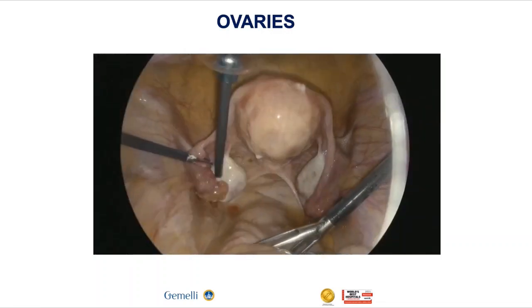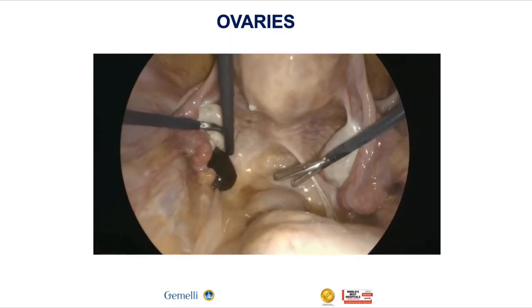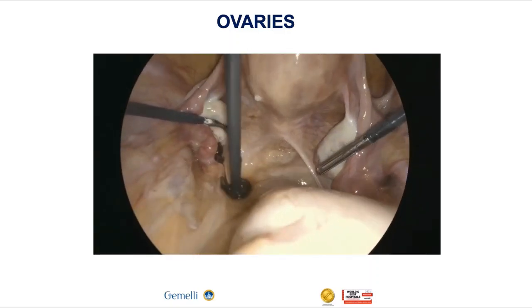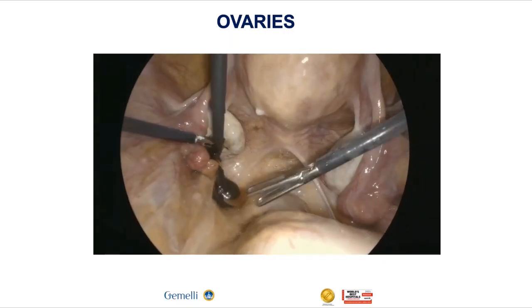We can see the laparoscopic view showing the left ovary with the cyst inside, and the ovary was fixed to the uterosacral ligament.